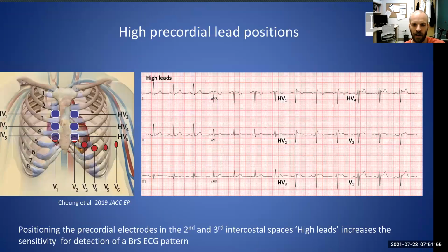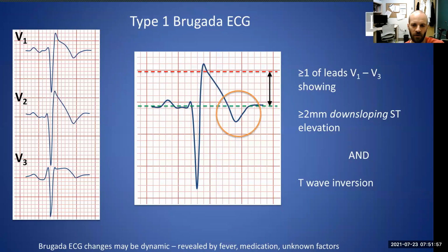So that's a great question. It's not where it becomes horizontal because there is no horizontal. It doesn't become horizontal until after the T wave. So the J point isn't where it becomes horizontal. It's where the QRS complex meets the ST segment, and that's a tricky thing to determine frequently.